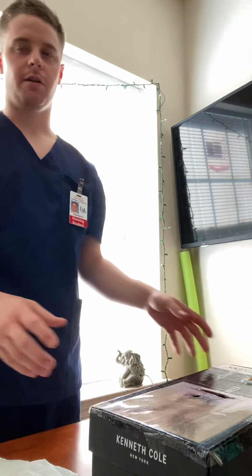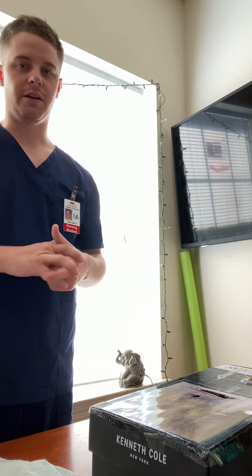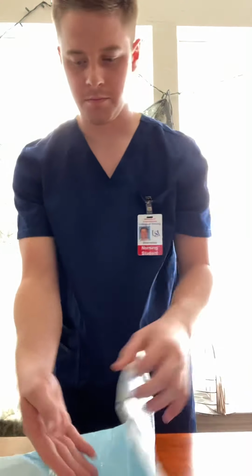I'm going to make sure the patient is positioned comfortably. Moving the camera, position the patient comfortably. I'm also going to lower the bed to its lowest setting and make sure the call light is available for the patient. And now I'm going to turn the camera again, dispose of all of my equipment.